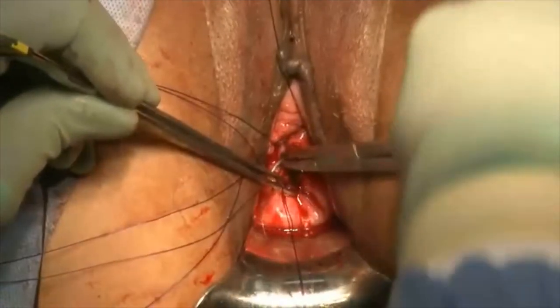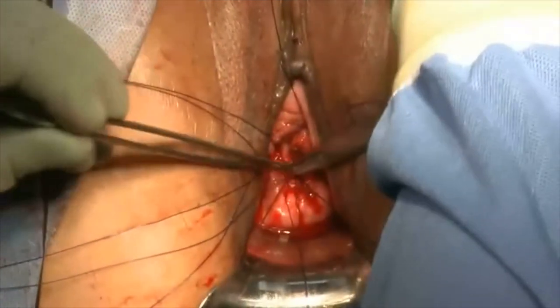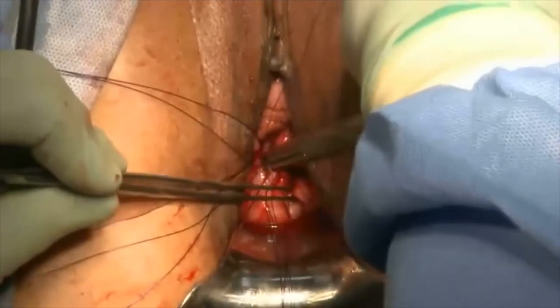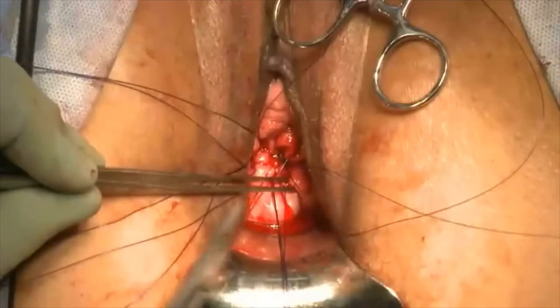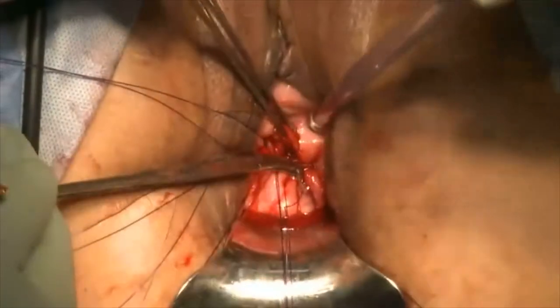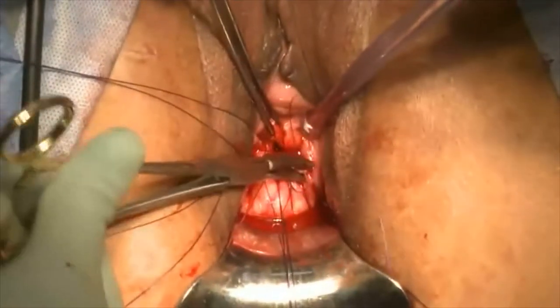Once all the sutures are placed, if there is still a gap in the midline, we use a figure of eight Vicryl suture to close the gap. But often there is no gap left, because you're concurrently suspending the cuff and closing the cuff with all these six PDS sutures.